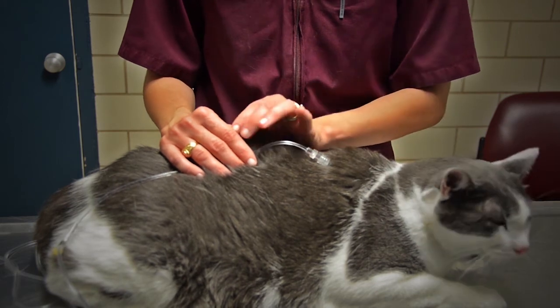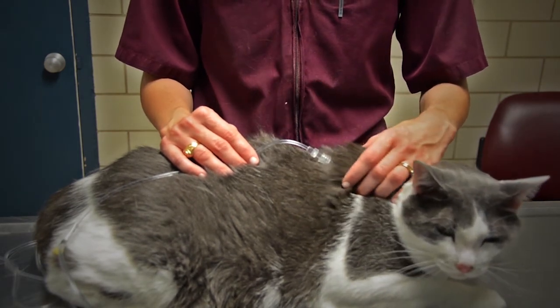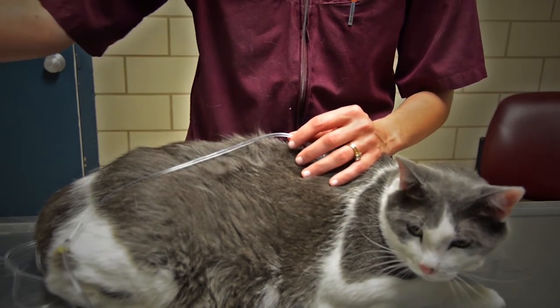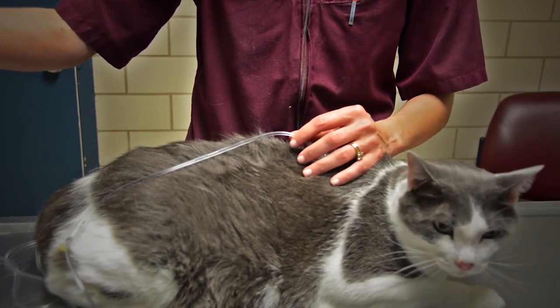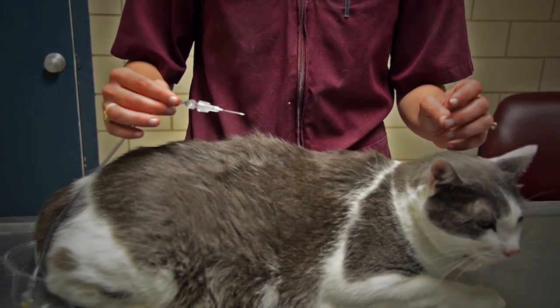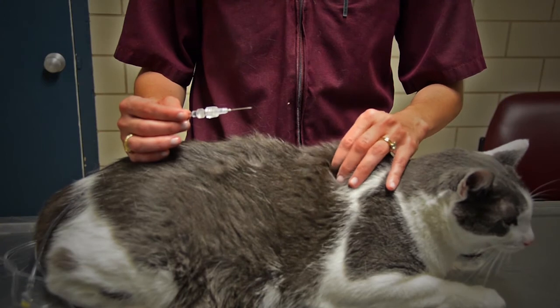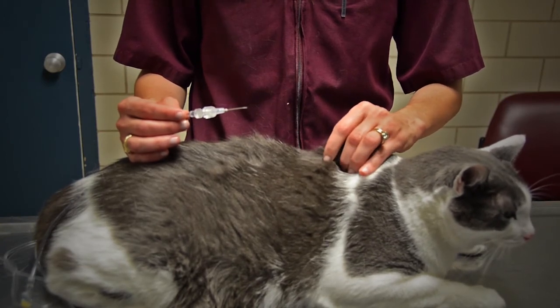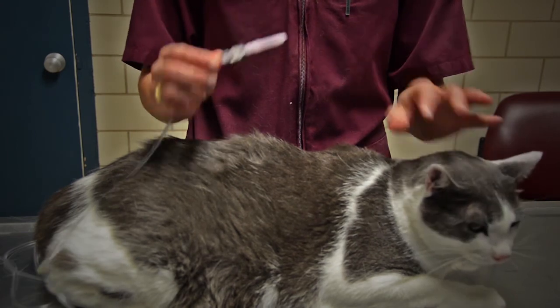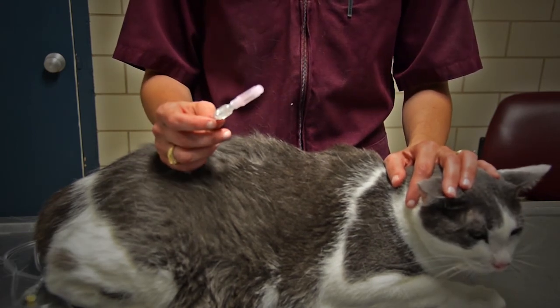So Skippy T has received his 100 mLs. You can see he has a noticeable ball of fluid right here in the center of his back. I'm going to discontinue the flow of fluid by rolling the ball down on my bag of fluids. I'm simply going to remove the needle, and sometimes I give it a little bit of a pinch right here just to close off where that insertion was made. And that's it. I always leave the dirty needle on, and I cover my needle after administration.